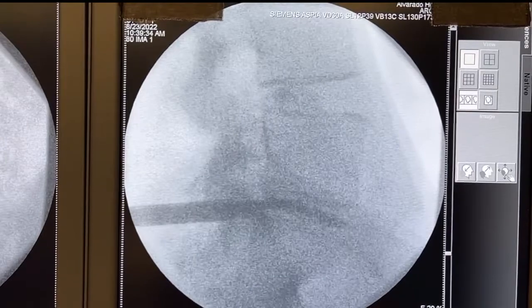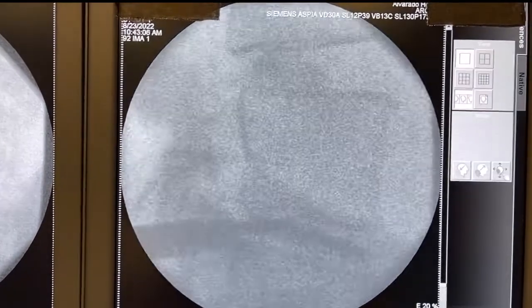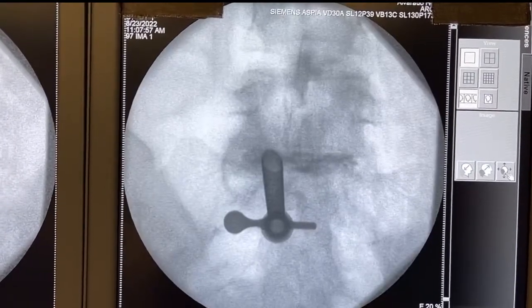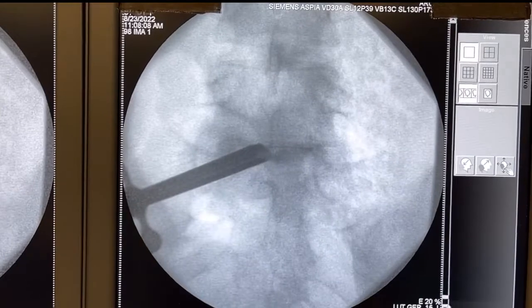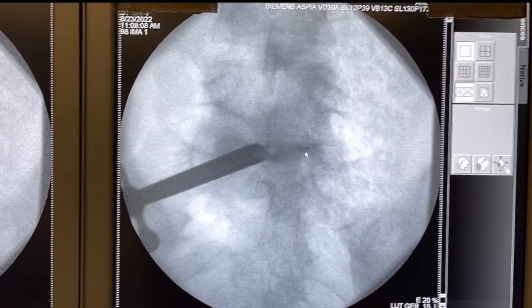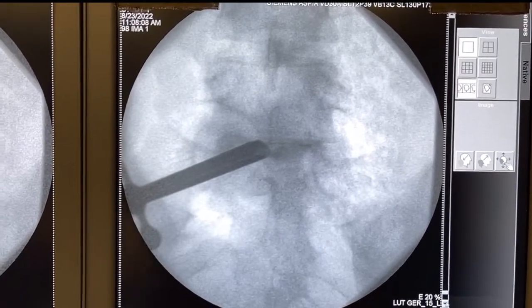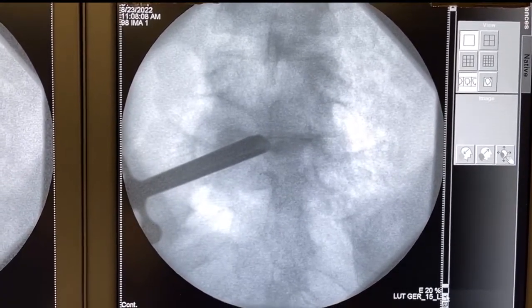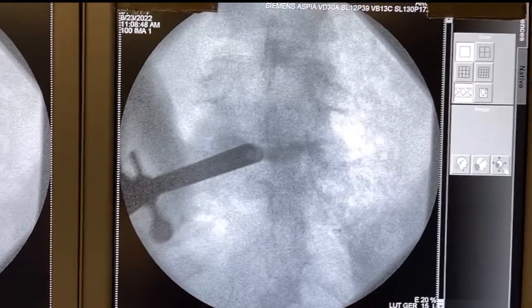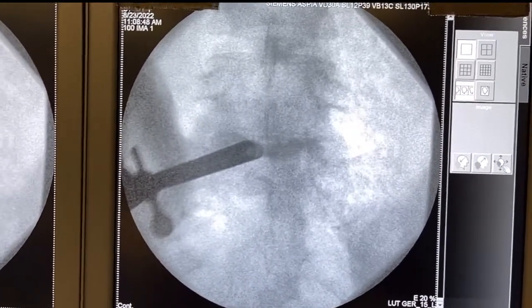Still dilating, still dilating. Look at how many times I had to do it. Finally got the cannula in right there. It's looking lateral. That's partway through the case where I'm reaching across. Look at this probe going all the way to the other side. That's how I know where I am, both by direct visualization and radiographic imaging, and I'm just looking all around. It went beautifully, so we're all expecting a great result, so best wishes on a speedy recovery.